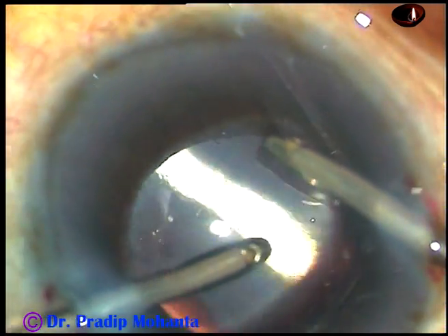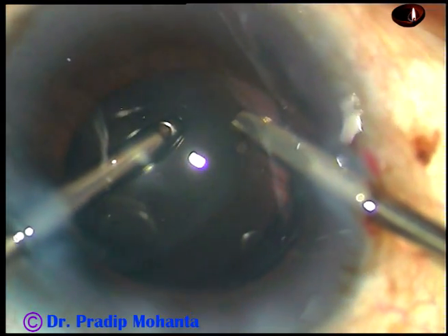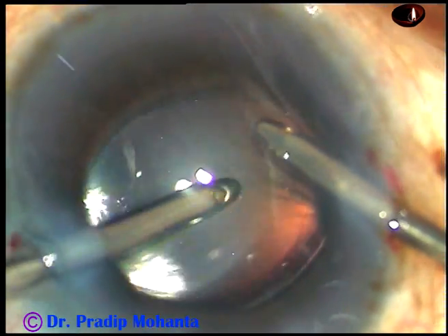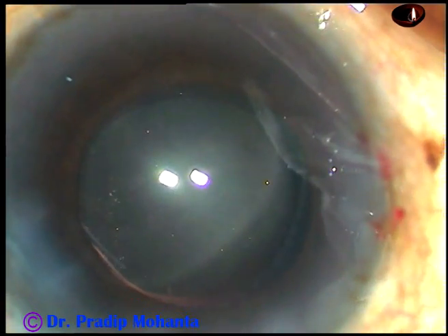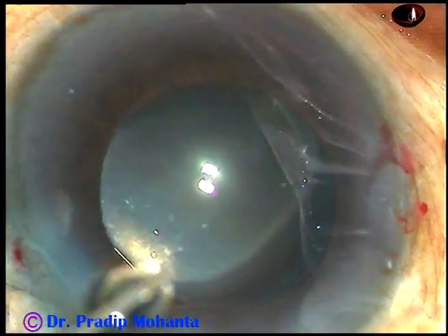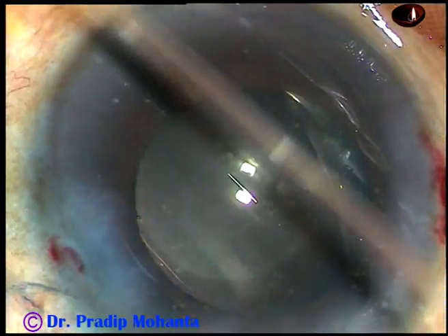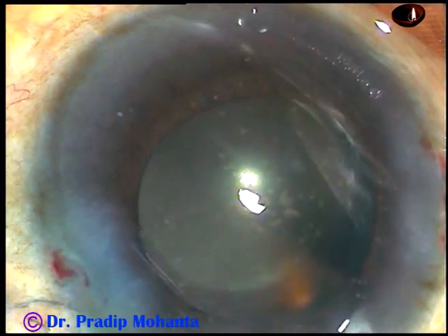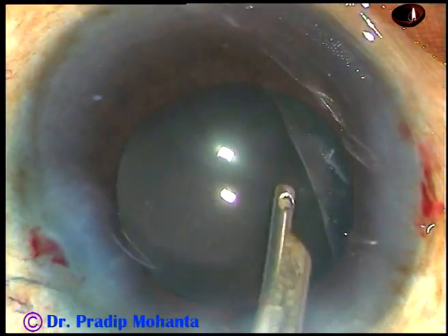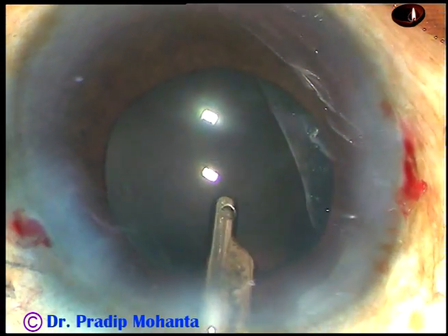Now, thorough cleaning of viscoelastic substance is done. After thorough cleaning, a bit of moxifloxacin is injected and the stroma on either side of the paracentesis wounds are hydrated to close these stab wounds. And then, the final lavage of the anterior chamber is done. The anterior chamber is formed very nicely and the case is concluded.